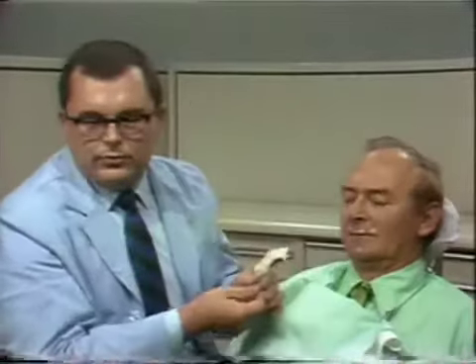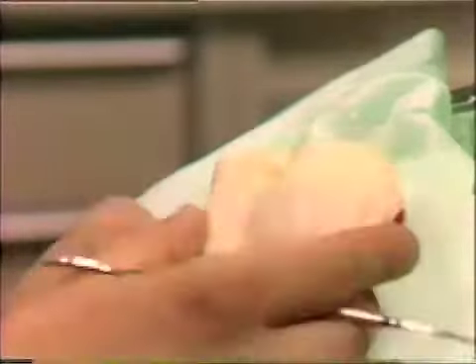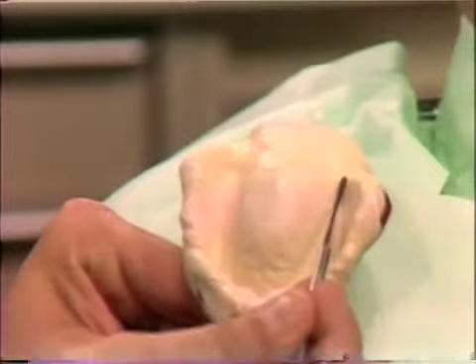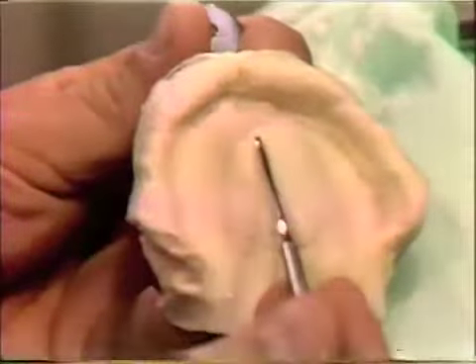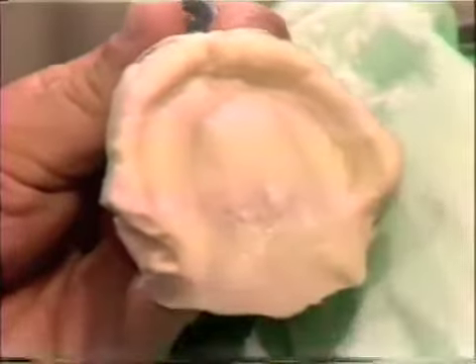I'd like to show you the areas we are most critical about in analyzing our preliminary impression. First of all, the hamular notch should show up very definitely in the preliminary impression. The flanges should be of a proper length and never under-extended if possible. The free areas should be defined, with no gross irregularities within the impression.